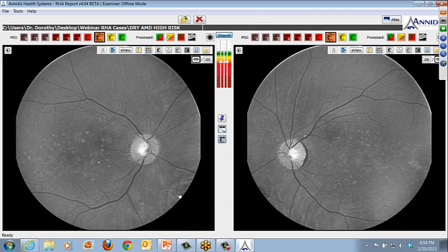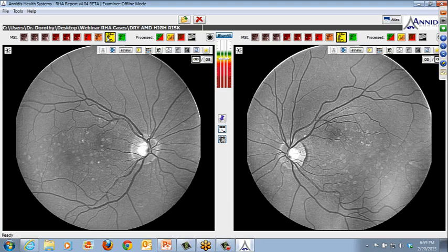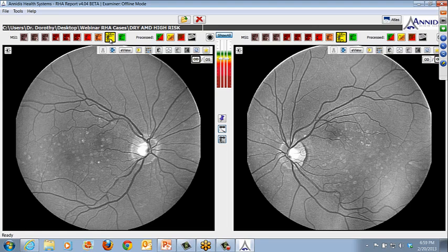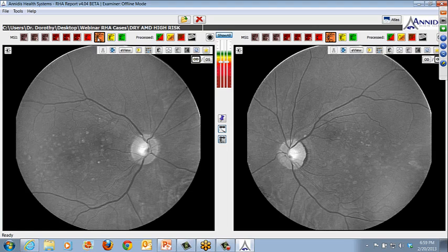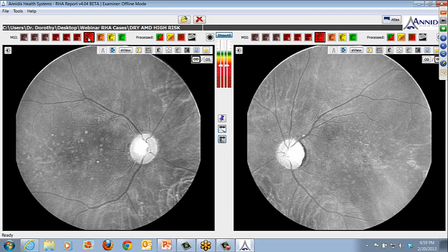Okay, so if you think back to the AREDS definition, AREDS category 3 includes at least one soft drusen as well as RPE atrophy. And in this particular patient, you can actually see both hard and soft drusen. Even though they're sub-RPE, they're large and big enough, and they're hyper-reflective. They absorb light differently than the RPE. So you're going to see those in the image, even in the higher wavelength views, despite the fact that their position is deeper in the retina, okay?